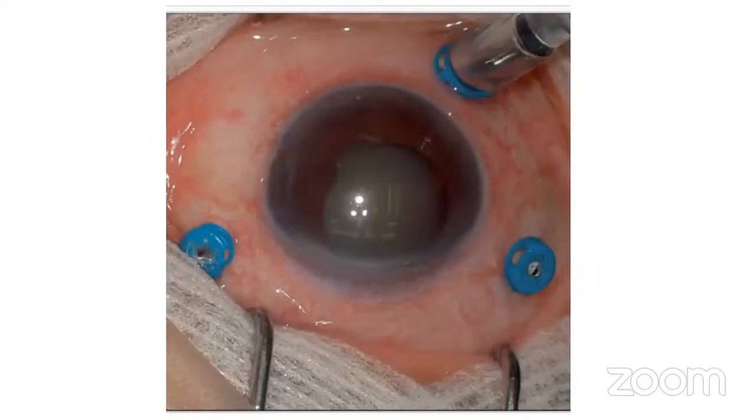So this is the image showing standard three-port pars plana vitrectomy. The infusion cannula is placed generally in the inferotemporal quadrant, where the superior nasal and superior temporal quadrant cannulas are used interchangeably for the vitreous cutter as well as endoillumination.